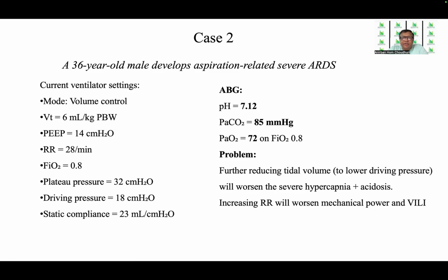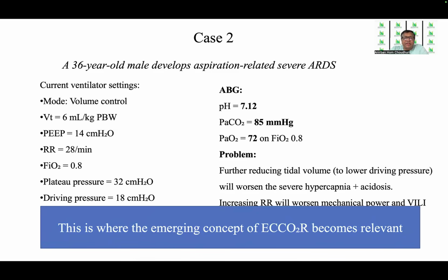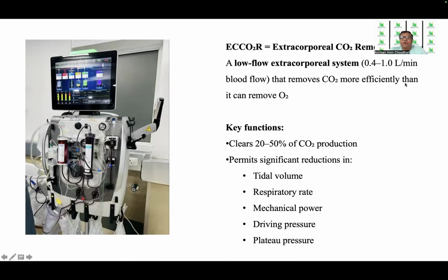Now, the problem is that further reducing tidal volume to lower the driving pressure will worsen this severe hypercapnia and acidosis, and increasing the respiratory rate will worsen mechanical power and also cause ventilator-induced lung injury. In such a situation, the emerging concept of ECCO2R becomes relevant. ECCO2R is extracorporeal carbon dioxide removal, a low-flow extracorporeal system with 0.4 to 1 liter per minute of blood flow, that removes carbon dioxide more efficiently than it can remove or deliver oxygen.